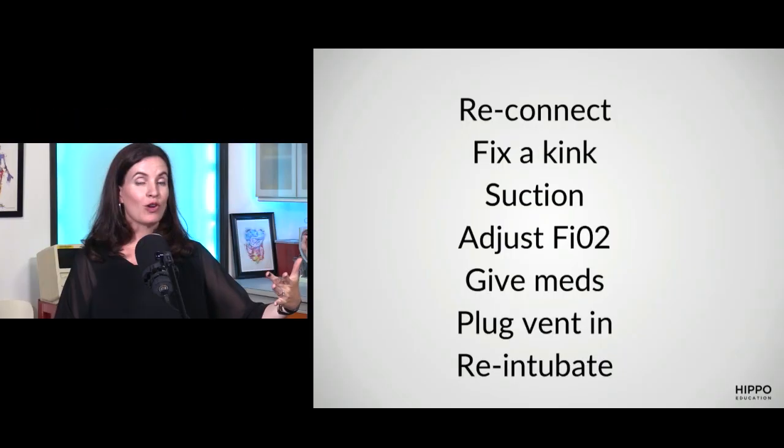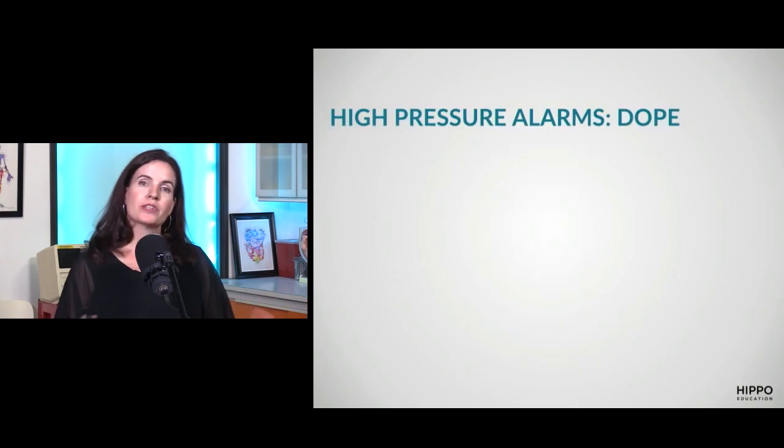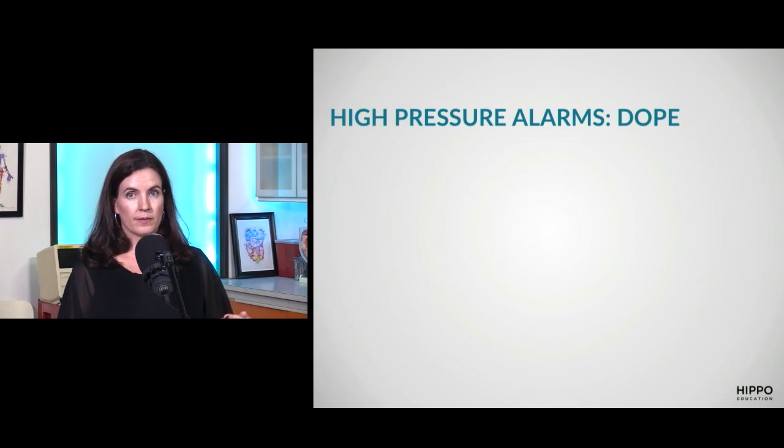All right. For all of the keepers out there, if you want to take this to the next level, step 5 is for you, where we start giving you an approach to the actual alarms. I'm just going to run you through our 2 most common alarms. High pressure is an extremely frequent alarm in the emergency department, and I use the mnemonic DOPE to run through an algorithm for this. Do you guys use DOPE? Do you know what that stands for?